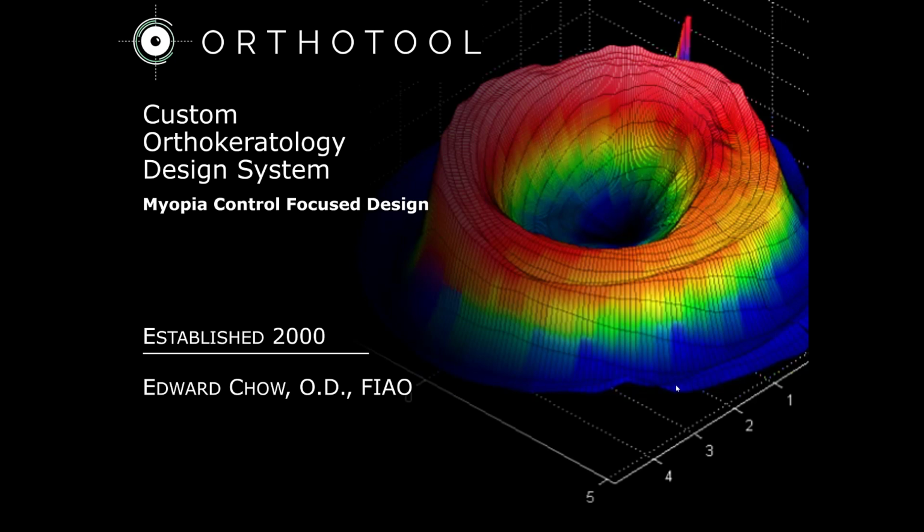Each Orthotool lens is custom designed for the unique patient wearing it. Our philosophy is simple. We give the practitioners complete control in designing a lens specifically catered to the patient's needs. Provided with a patient's age, refraction, corneal topography, and visual needs, the Orthotool system allows for a high degree of customization across multiple zones in the contact lens. Designs can vary from simple, allowing the fitting software to take control and select the initial parameters, to complex, allowing the practitioner to control every lens curve.